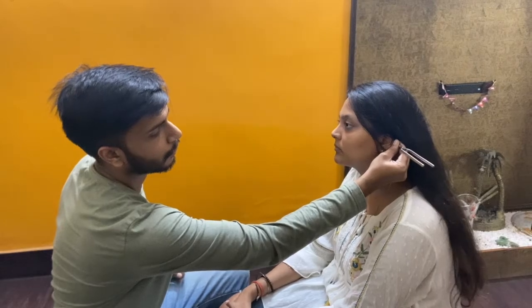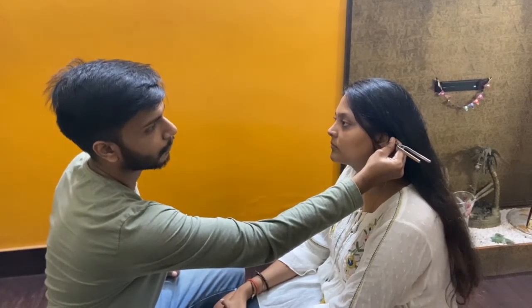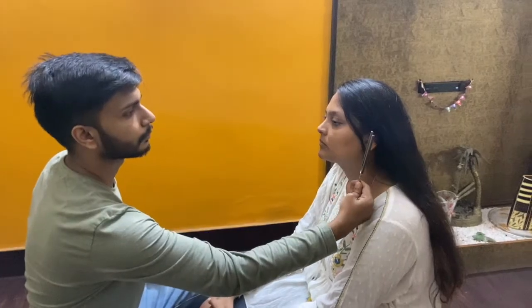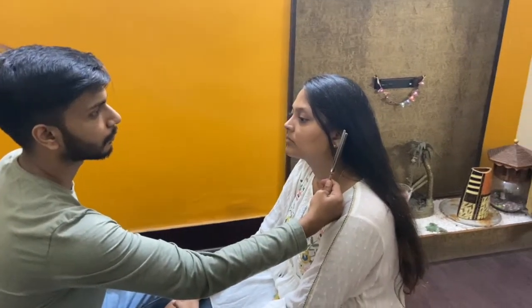Now to perform Rinne's test, I have to place the vibrating tuning fork on the mastoid. Now I have to ask the patient to tell me whenever she doesn't hear the sound anymore. Then I have to place it in front of the ear canal. Normally, air conduction is greater than bone conduction. In conductive hearing loss, bone conduction is greater than air conduction, while in sensorineural loss, air conduction is greater than bone conduction.